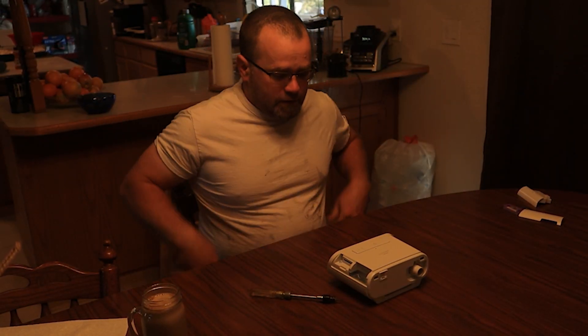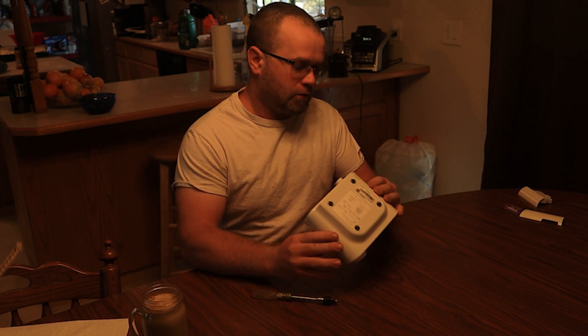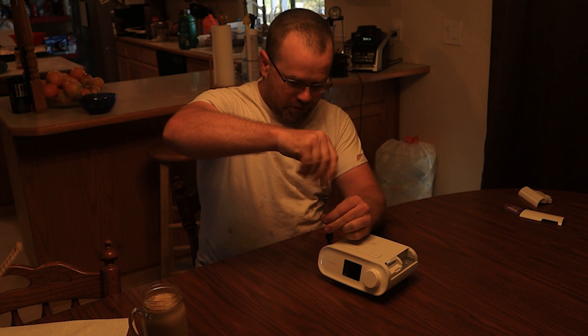This is Friday, July 2nd, 2021, and I'm going to remove the possibly toxic foam from this Philips Respironics CPAP machine.